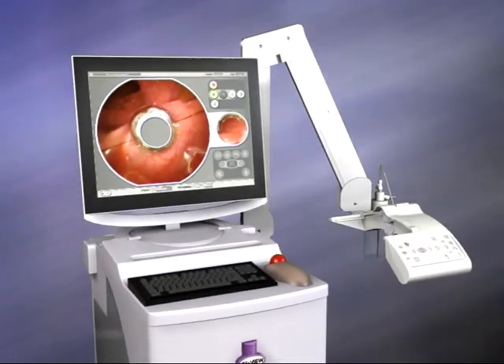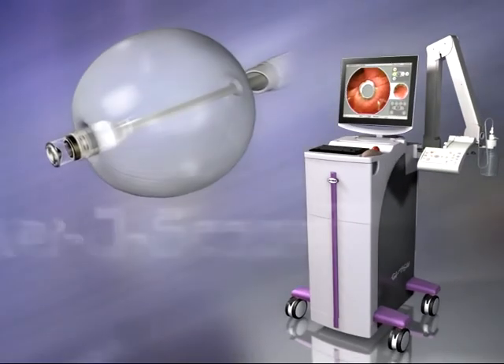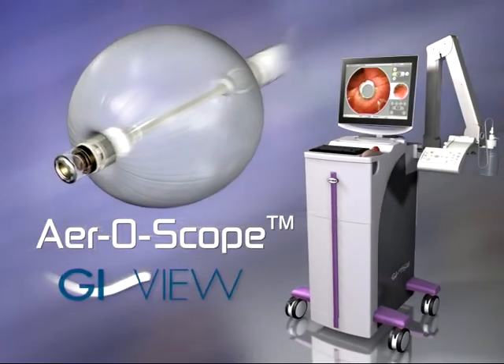This is Aeroscope, the ultra-flexible, miniature, disposable, self-propelled and self-navigating colonoscope from GI View.